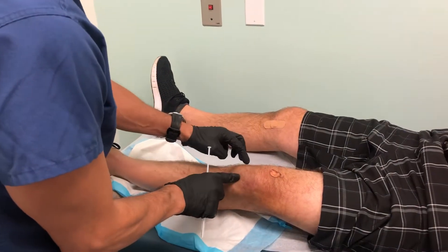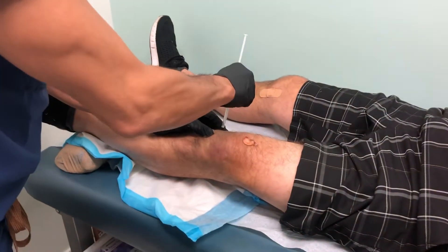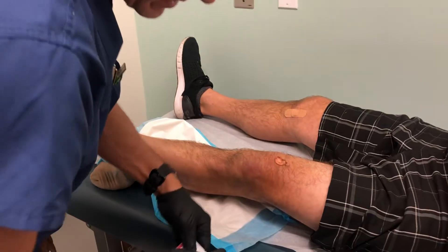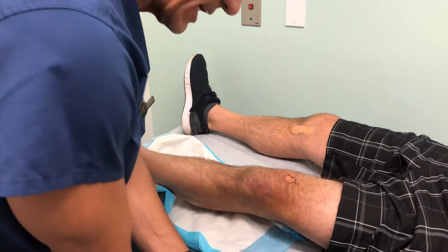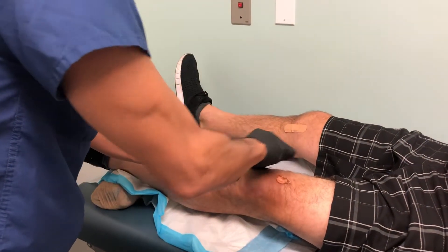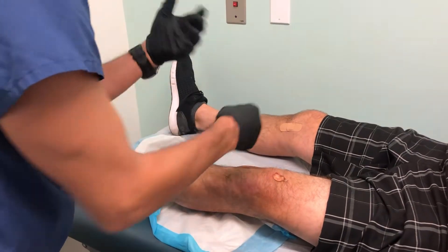What I do is I find the joint line and I'm going to make a little mark on it here. We're doing platelet-rich plasma today and we're doing high concentration platelets, so we're using the M-site system here, which is a double spin type system — in comparison to the simpler single spin systems, which don't concentrate platelets very well.